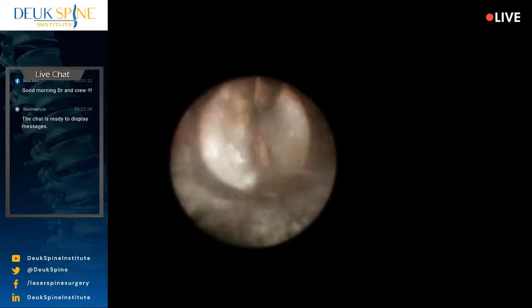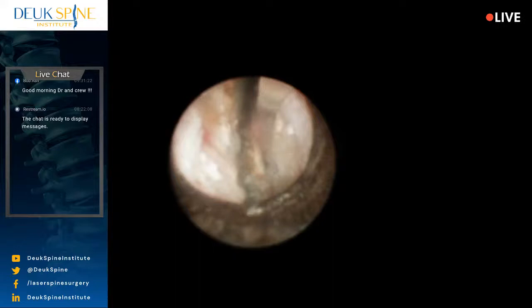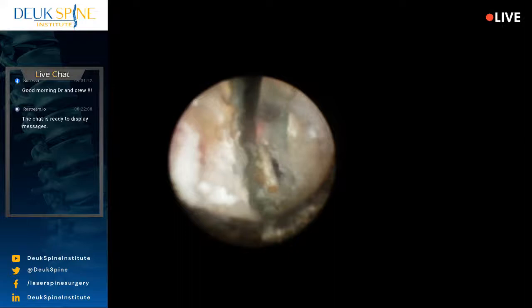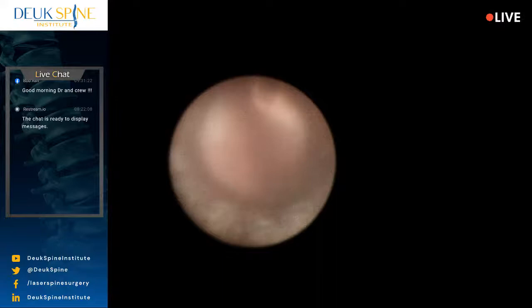But this surgery typically gets rid of 90% if you treat all the discs that need to be treated. Now, not every patient wants to treat all the discs. They want to treat just a few, maybe one in this case. And like I said, this patient in particular has more than one abnormal disc, but we're just treating the one disc, the one that we believe is causing most of her symptoms.